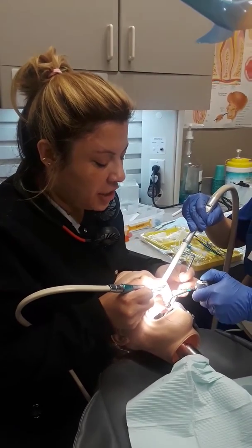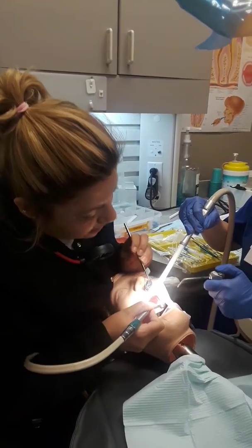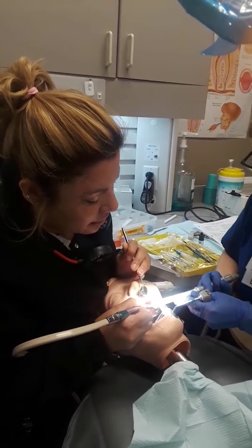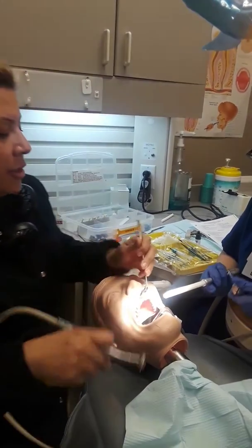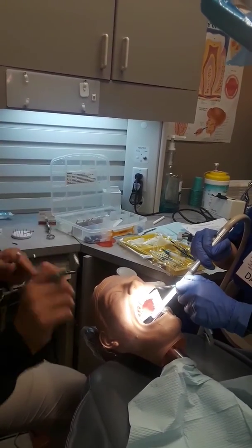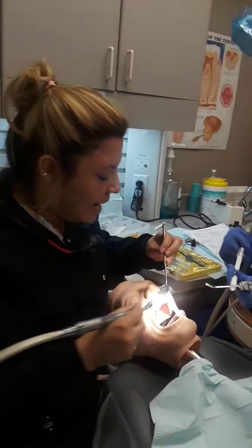She's focusing on my mirror because I need to see through my mirror. Let's switch sides, go to the back. Meanwhile, she's going to blow air only — no water — and dry off my prep, because it needs to be dry for the slow speed.